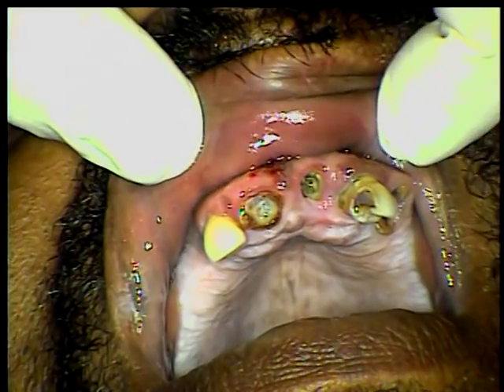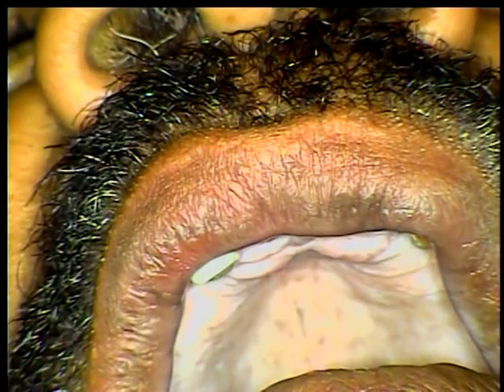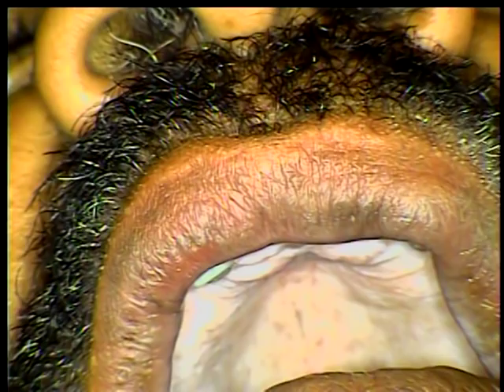Teeth number 8, 9, and 11 — there's nothing there. Right now, if you were going to take those teeth out, you'd probably have to lay a flap and do surgery. That's unnecessary with the physics forceps.